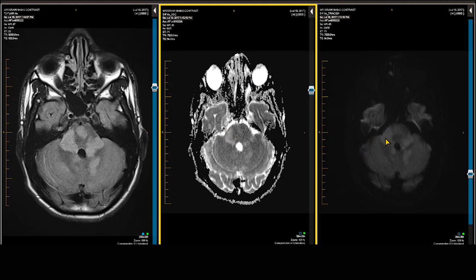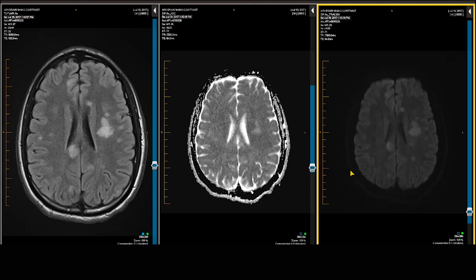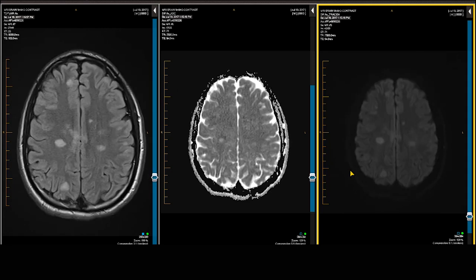On the ADC map, T2 shine-through is bright in signal intensity, whereas active cytotoxic edema is going to be dark in signal intensity.